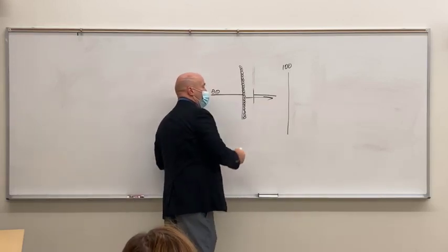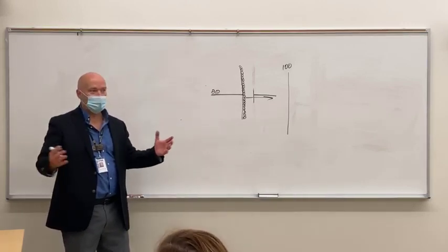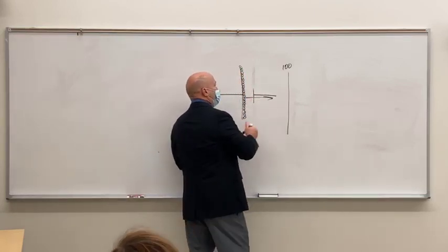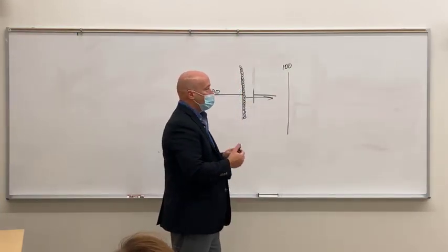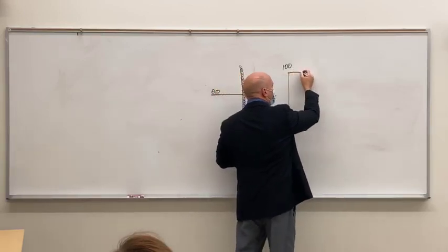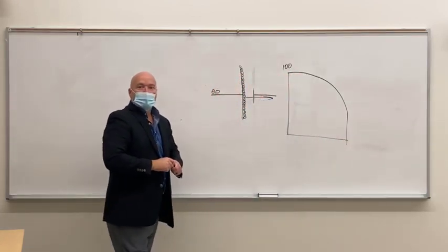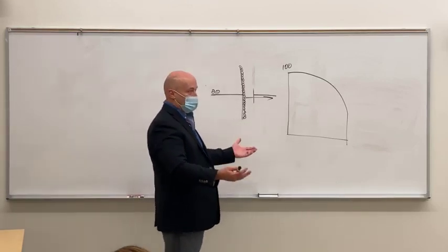But once we let them go on the other side, what are they going to do? They're going to spread out. So here's the key to a capacitor discharge. Once those electrons jump across, they're still going to be crowded together, so your 100 kVp works as 100 kVp. But throughout the exposure, because they're starting to spread out, your voltage drops to a point where eventually it's just ineffective. So what you have with a capacitor discharge unit is basically a single shot battery.